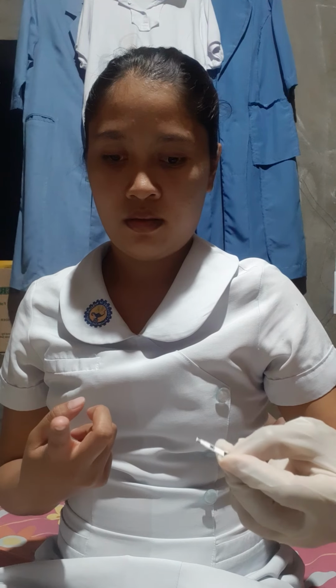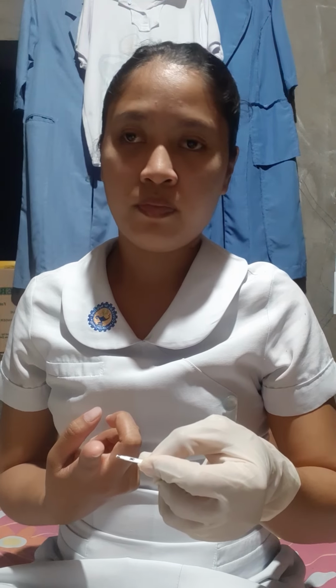So after darting it like that, we need to place the strips and expose the blood to the strip to have the blood sample on it.